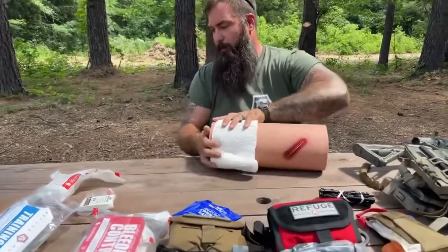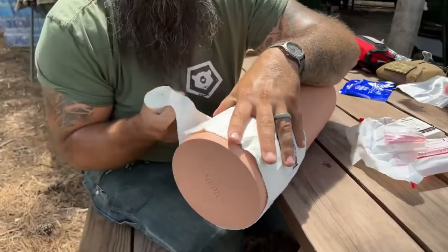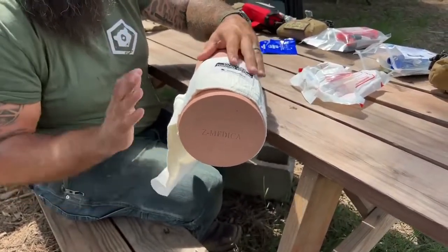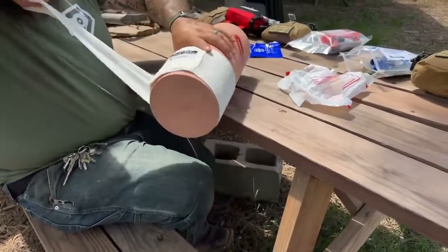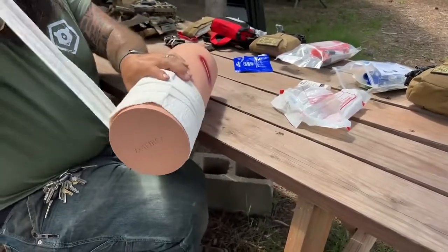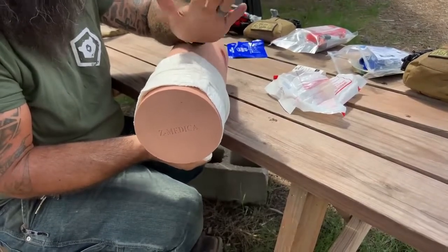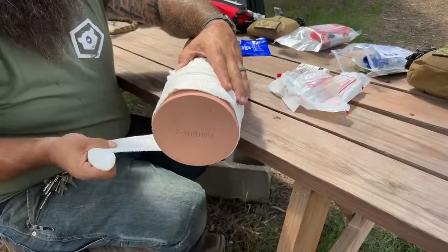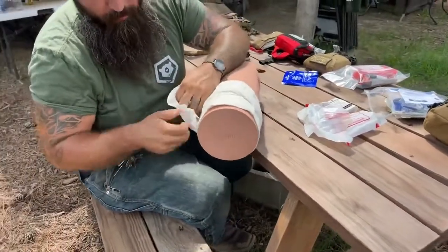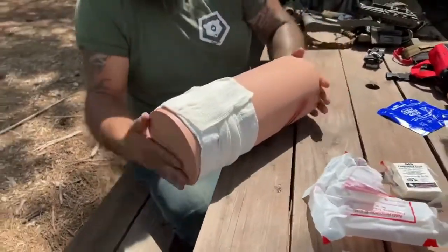I'm going to hold pressure on this, pull just enough — not a ton yet — to get this around to the Velcro strip so it sticks. Now it's on. Now I can apply some pressure because this is a pressure bandage. I'm going to pull and twist and center that twist over the top of the wound, pull again and twist again, centering that twist over the wound to localize pressure there. We go from six inches wide down to three-quarters of an inch wide over the top of the wound, getting direct pressure on that wound. I'll do it a third time — pull and twist — then continue wrapping around. On the end is a very large piece of Velcro; take that and press it down. Pressure bandage applied.